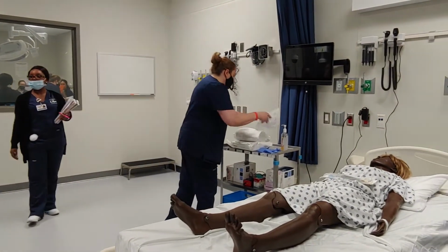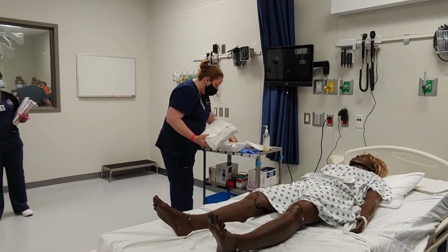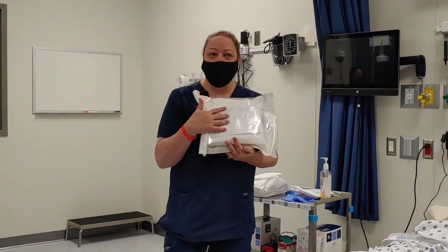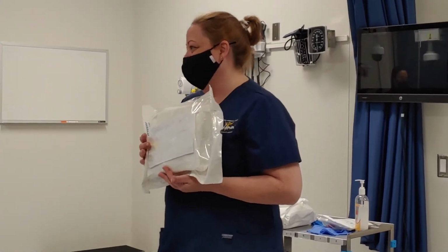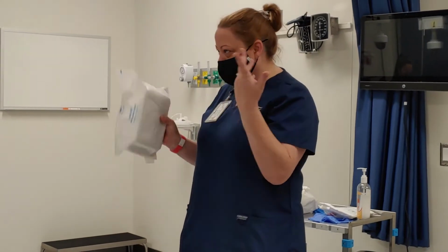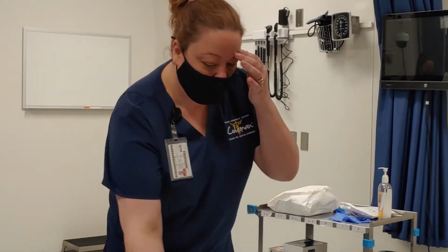Okay? Now, I do have a kit here. This is a straight cath kit. So this has everything in it that you would need to straight cath somebody. Again, straight cath meaning we put it in, we take it out. Okay, so that is a sample of those.